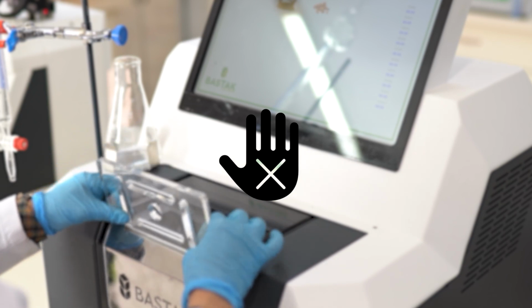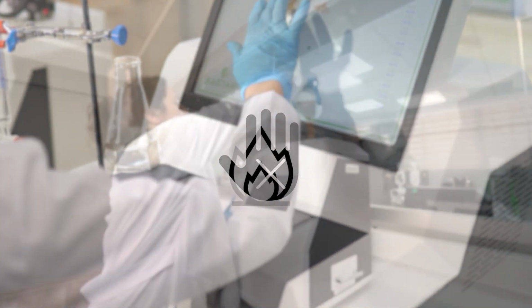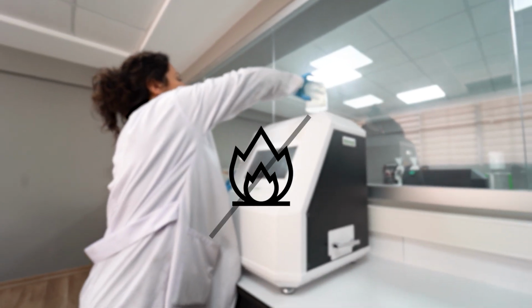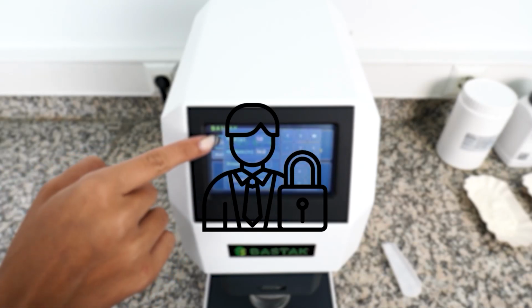The device must not be used by persons other than the operator who knows how to use the device. Flammable and combustible materials must not be kept on or near the device. Unauthorized persons and companies should not be allowed to interfere with the device. Bastak technical service should be contacted in case of any problem.